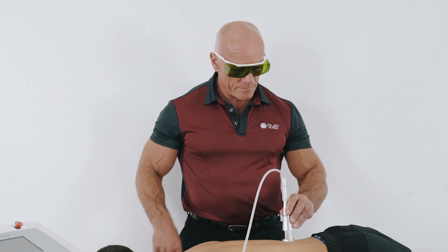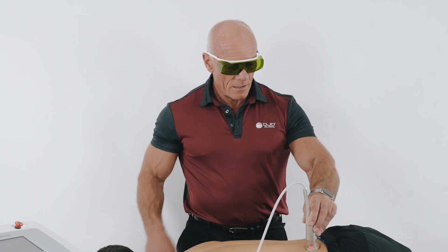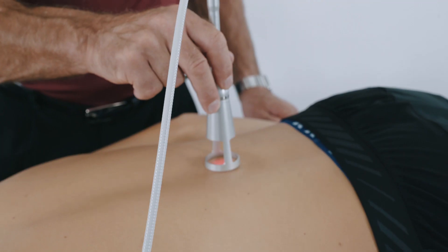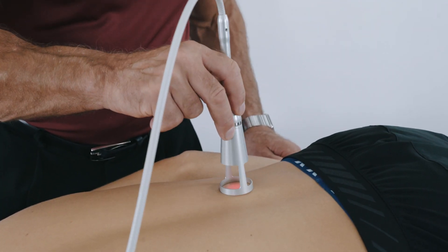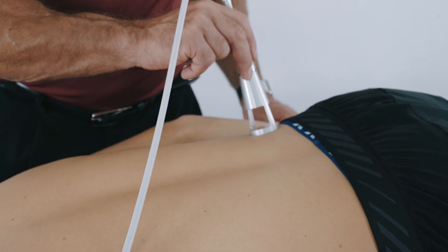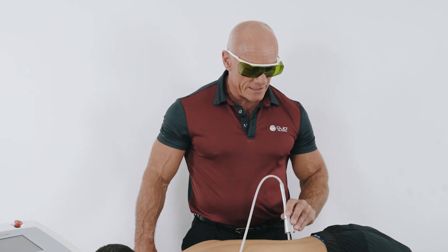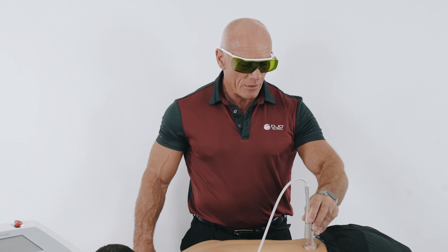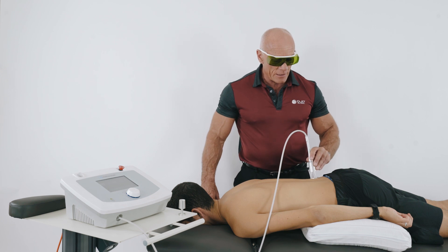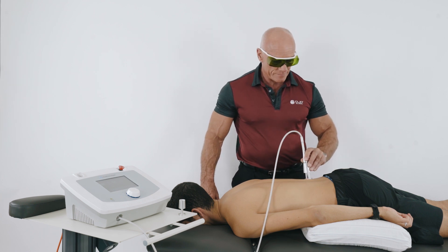You'll note that I'm using a slower technique with the lower energy density standoff. If I'm using the smaller standoff with a higher energy density, I work quicker. Now, if you have a patient with a tattoo, because we have a thermal effect during phase three, it's important we communicate continually with the patient. And if we go over that tattoo, we need to work quite a bit quicker because the thermal effect will warm up the ink in the tattoo. Or indeed, if they've got a large area of tattoo, you might have to reduce your energy power by 50%.